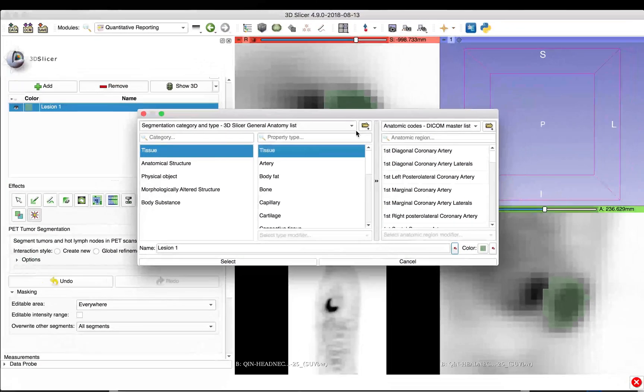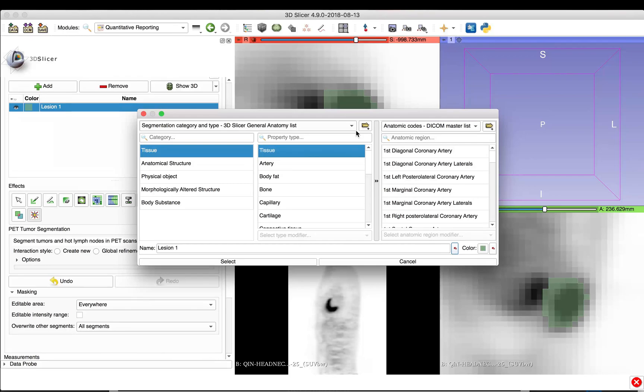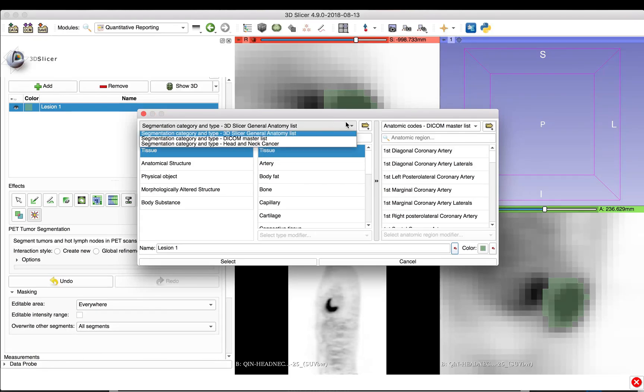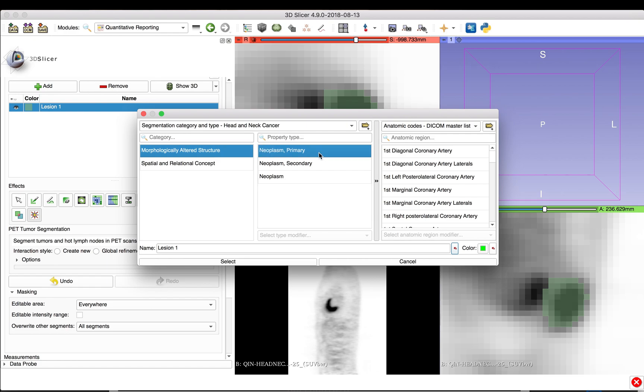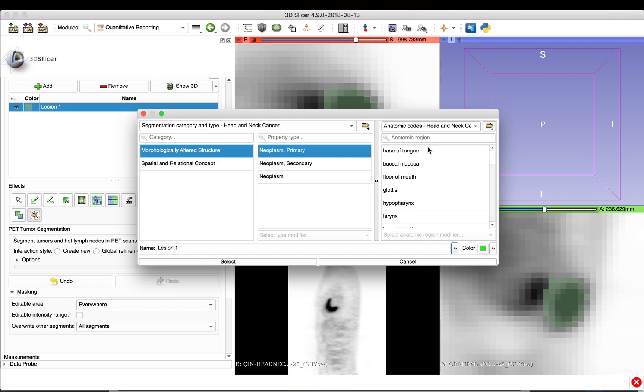By default, slicer shows an extensive list of terminology codes. The installed PET indice extension provides lists of terminology codes more specific to head and neck cancer. Thus, we can select this list and label the segmented lesion as neoplasm, primary, located at the base of tongue.